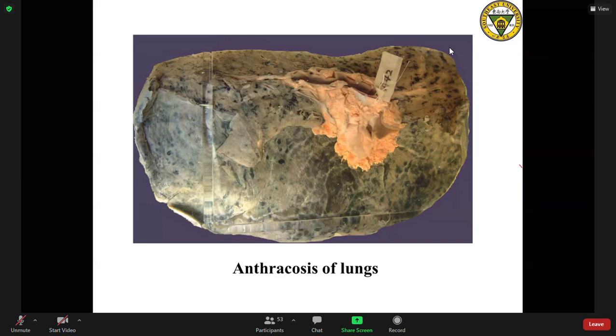Sure, this carbon dust enters our bronchi and alveolar cavities, and also can be imbibed by the macrophage. It can be eaten by the macrophage and form some dust cells. We see the dust cell, it means in the cytoplasm of the macrophage, you can see some black or dirty particles, the dust cells.